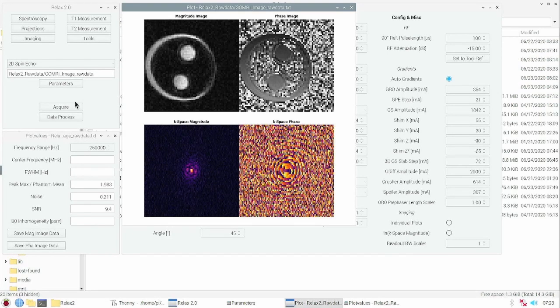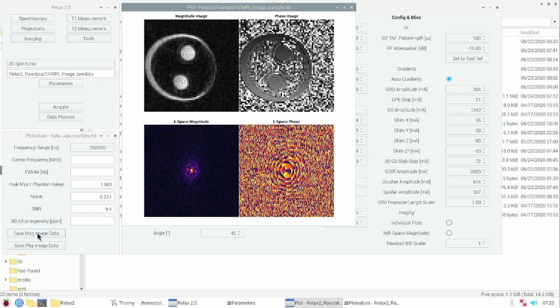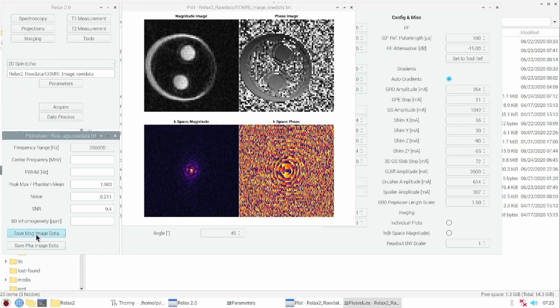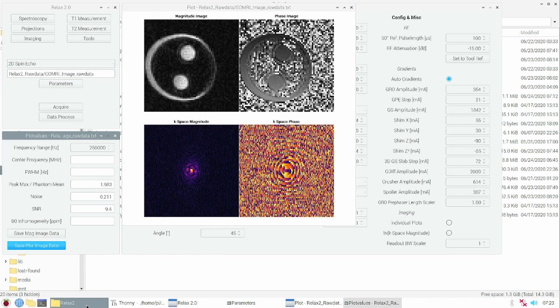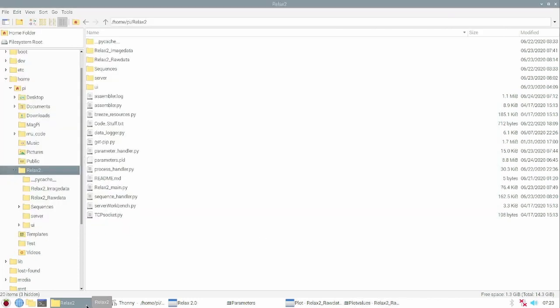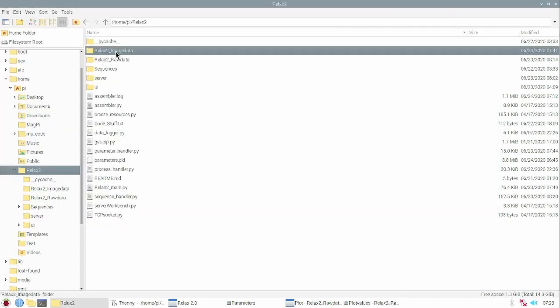After reconstruction, image data can also be stored. In the plot view that shows you the image parameters, you can click on save magnitude image data and save phase image data. This can be found in the relax folder, in the relax2 image data folder.